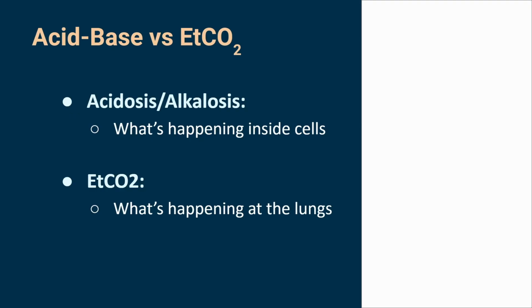What I don't want is somebody to be like, oh man, this guy with wheezing is hyperventilating, but he's also got trapped air. If his end tidal is 23, and then I put him on the da-da-da, I'm like, right. But in the meantime, the EMT's giving him a bronchodilator and saving his life. You see what I'm saying?